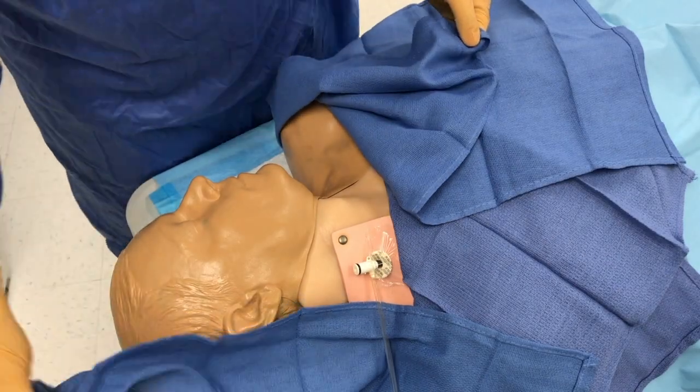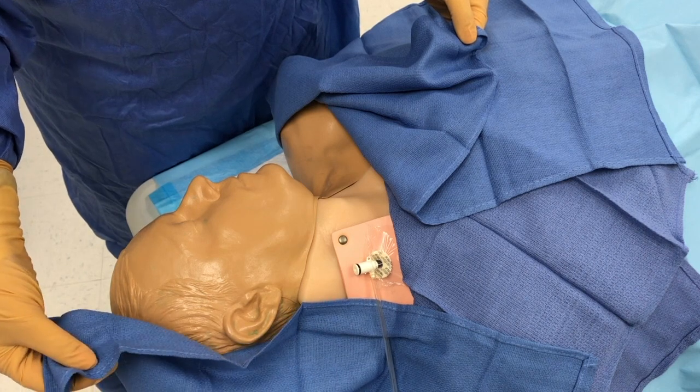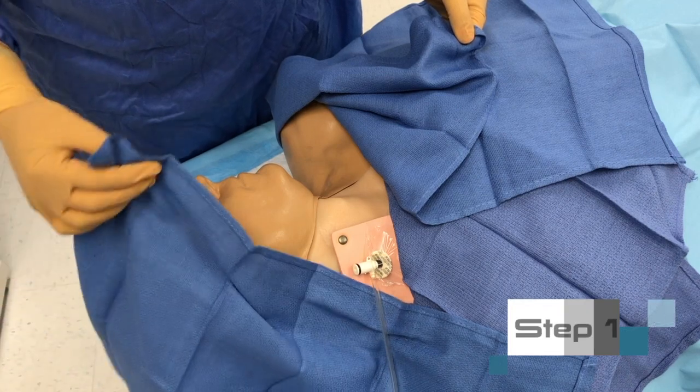In order to perform a PA catheter insertion, you must first have a central line inserted with an introducer hub that allows passage of the PA catheter. A second person will be needed to assist in the procedure. The first 6 steps will describe how to prepare the PA catheter for insertion. Step 1. Maintain a sterile field.